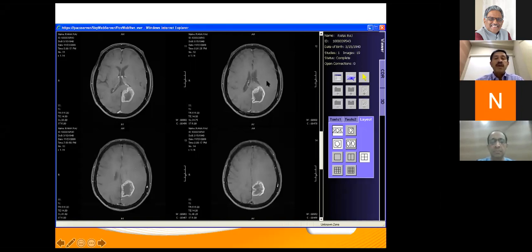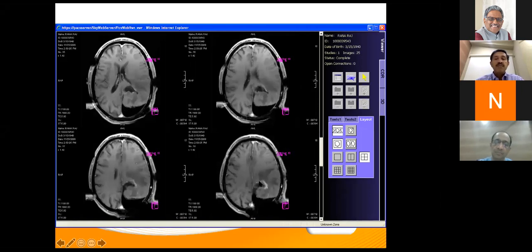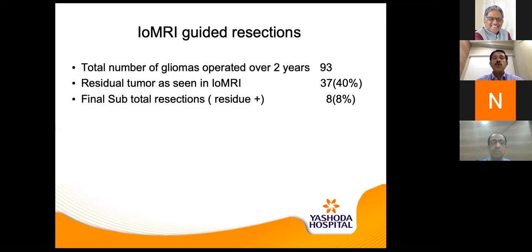Another example of a peripherally enhancing tumor, deep-seated: you see, blind areas can be left behind. So using fluorescence alone does not give you a guarantee that you have resected completely. Intraop imaging will pick up the blind areas where you are not able to see. So once you see this, you can go back in and remove it. So always intraop MR, if available, should be used as a gold standard at the end. The only thing is it will delay your scan later. So if you did not have a lot of tumor left behind, you need to do very little work after the intraop MRI.